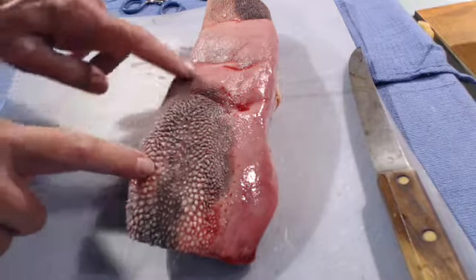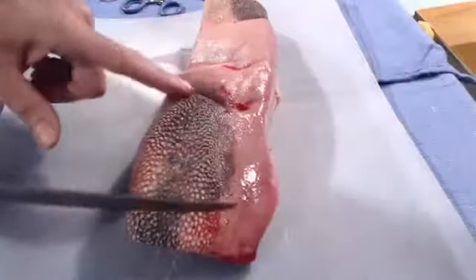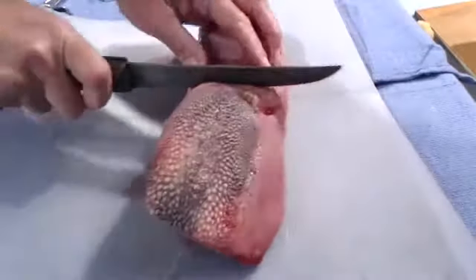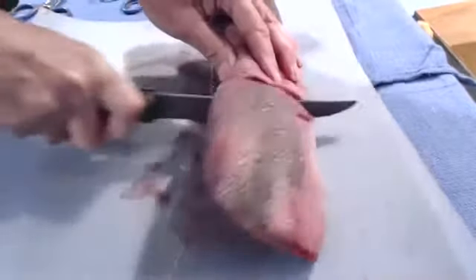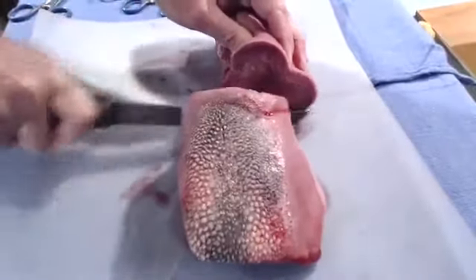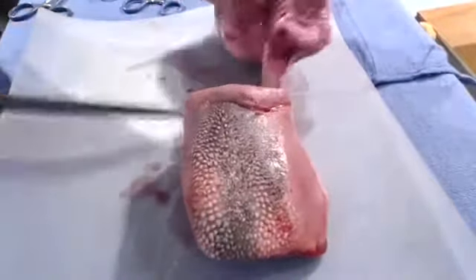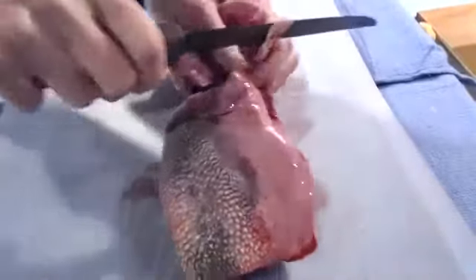So this is a whole beef tongue here. I'm going to take my knife and here's the area that has the taste buds and I'm going to cut just beyond it to make two separate models. You want a good sharp knife whenever possible.